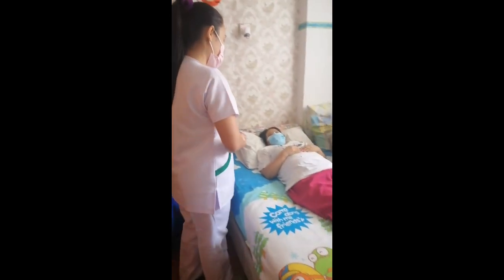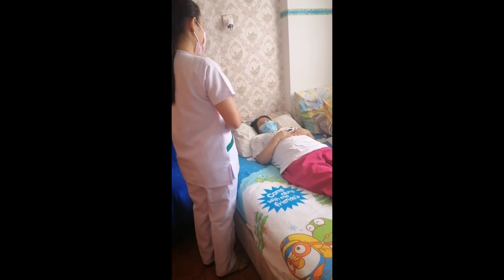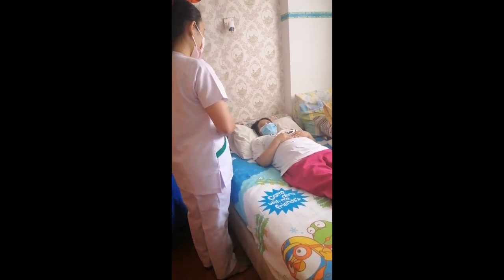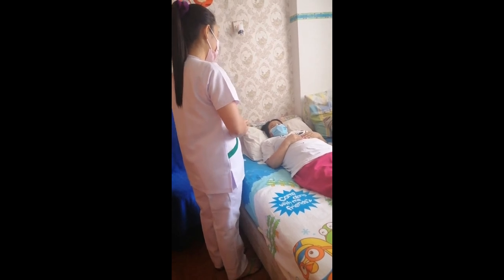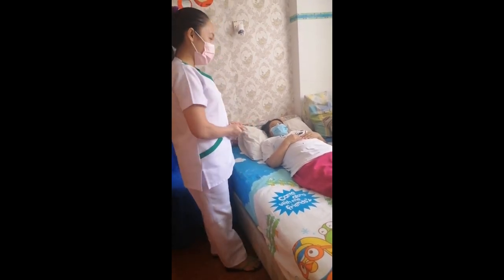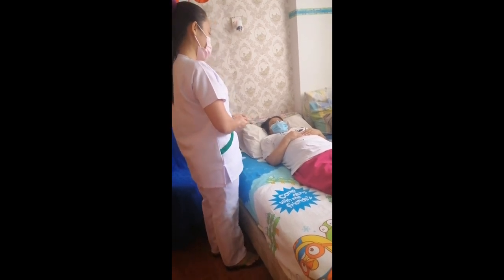Before we start, we have to introduce ourselves to the patient, and ask the patient's name and age. So, hey madam, this is Filma, and how are you? May I know your name? My name is Lucy. And your age? I'm 41. Okay. Today I'm going to transfer you from bed to wheelchair. Is that okay?